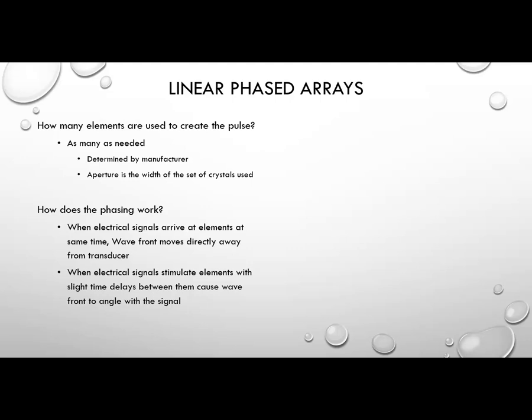So how does the phasing work? Again, the electric signals arrive at elements, and if they all arrive at the same time, the wavefront will move directly away from the transducer. When electrical signals arrive with slight time delays between them, then that can cause the wave to form an angle or a focus because of what I've already described. So that is how the phasing works.